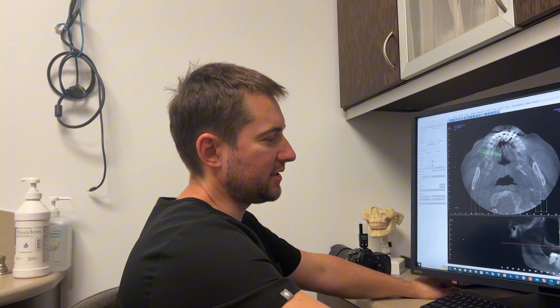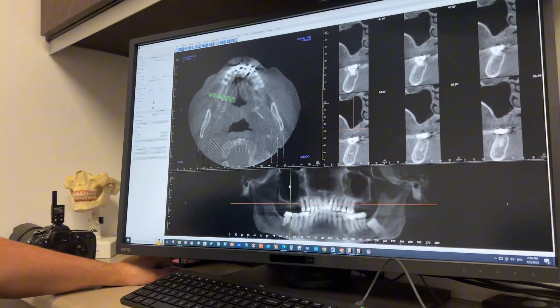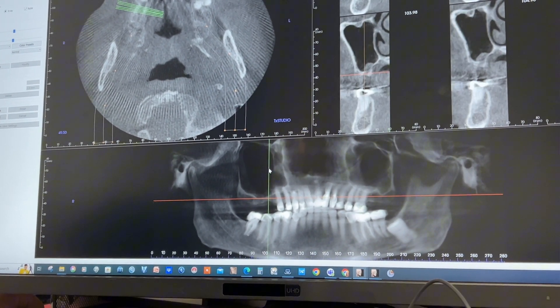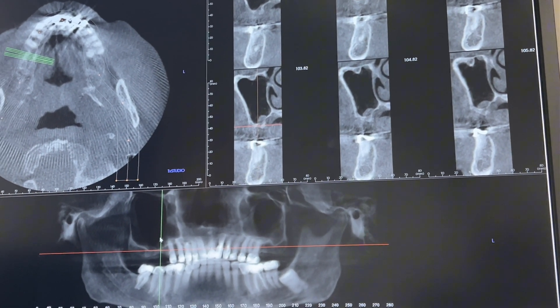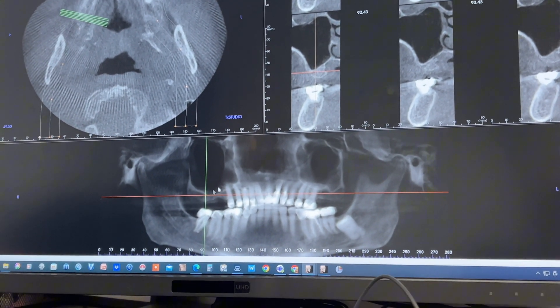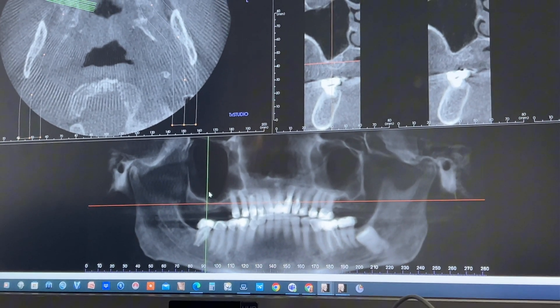Interesting case here with a sinus lift surgery. A lot of times we're able to place the implants at the same time with the sinus lift if we have at least five millimeters of bone. Here we do have five millimeters of bone, but only in the posterior aspects of the sinus, so we're just going to place one implant, and you want to plan that accordingly.